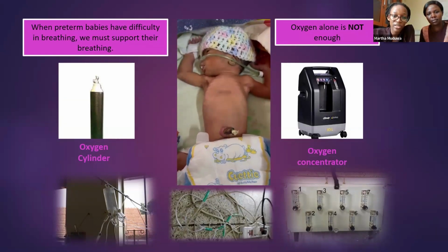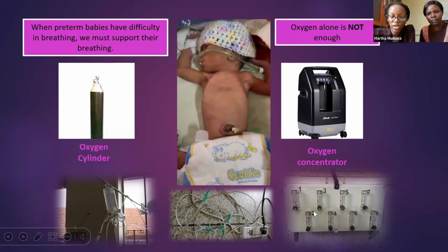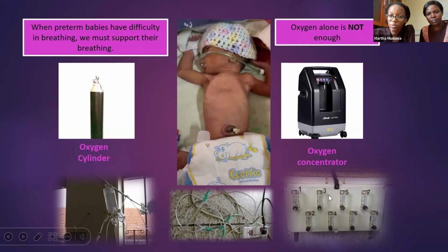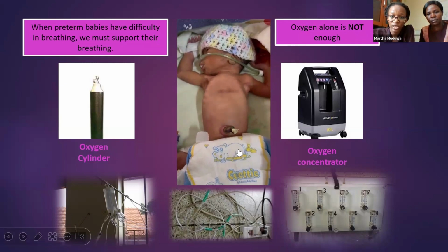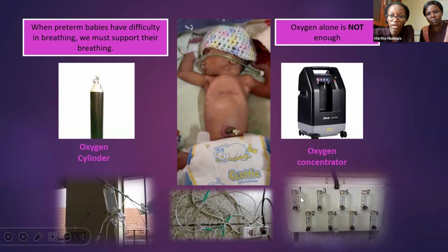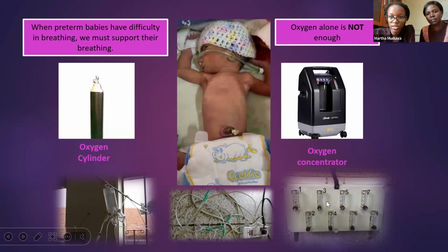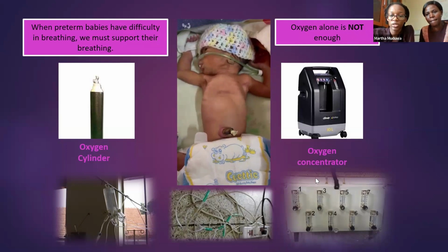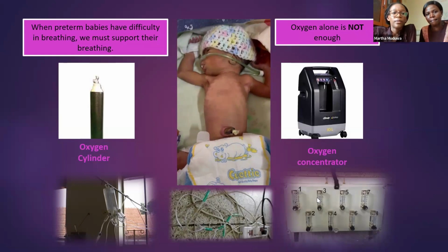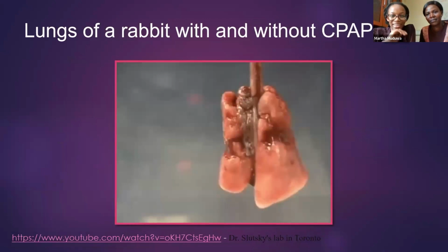Someone puts a stool over it, then the tubing is all blocked and you're not giving any oxygen. So the best way to share the oxygen would be using flow splitters. This is an affordable way that you can have one concentrator or one cylinder running for more than one baby. And this is also really important because you can regulate how much oxygen each infant is getting, and you're sure of how much you're giving to each baby according to their need.